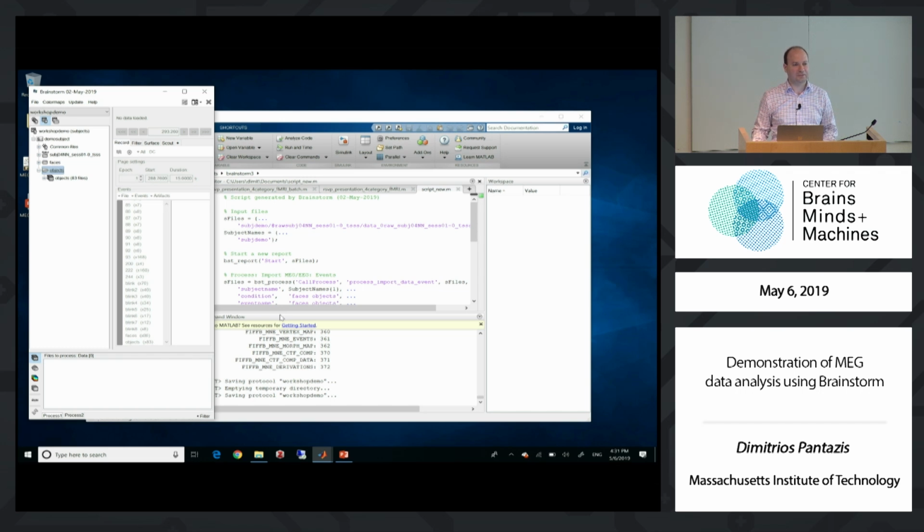Unfortunately, it doesn't write FIF files, no. But there may be other ways to do that by saving some structures and then importing the original data and some other structures. But no, it doesn't write FIF files. Yes. You will often find that different softwares are good in different things, and eventually you may be combining things sometimes in non-conventional ways. It happens to all of us.